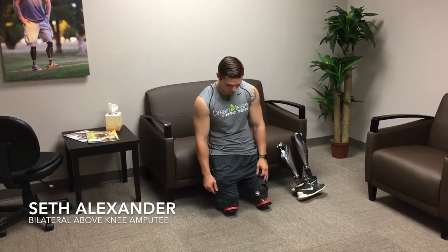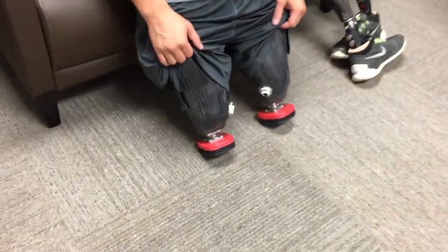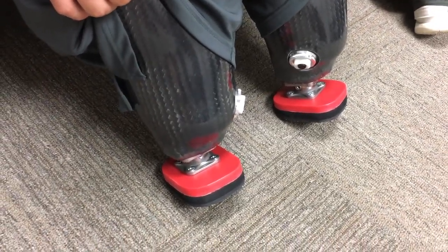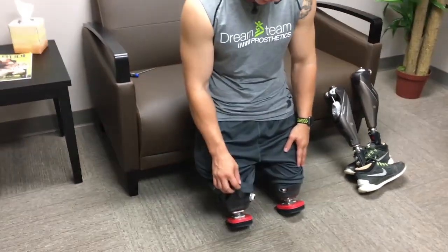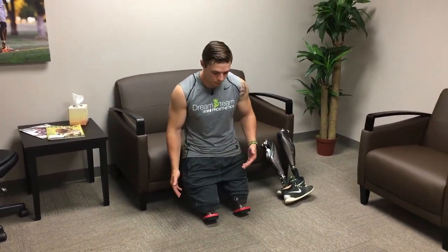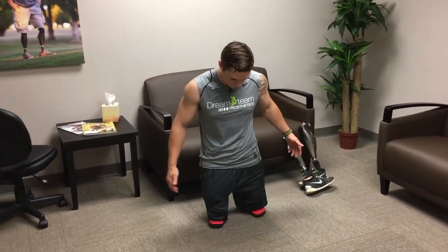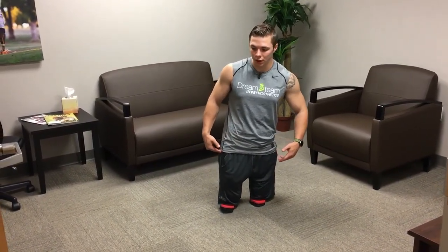Hey guys, what's up? I'm just going to show you some perks to having stubbies and utilizing stubbies. These are a very versatile tool to use anywhere at any point in time throughout the day. I use mine a lot at my house and in the gym. They're very good for exercising and good for building up endurance in your legs initially after being amputated and then fit with prosthetics.